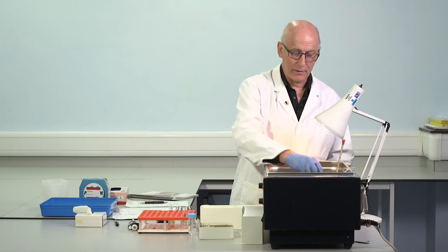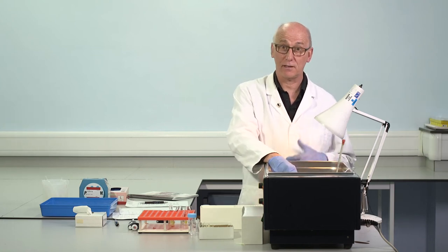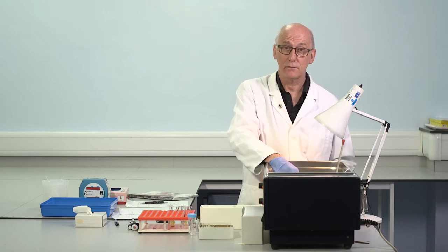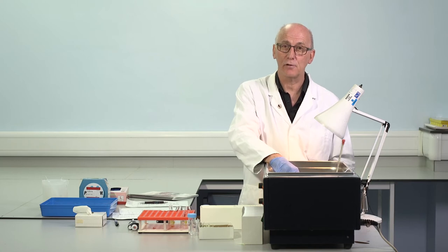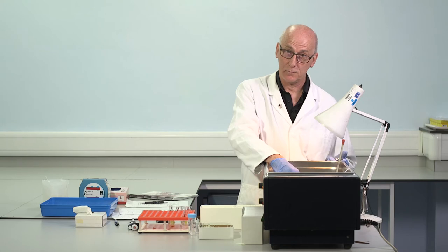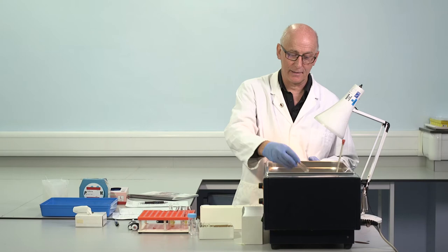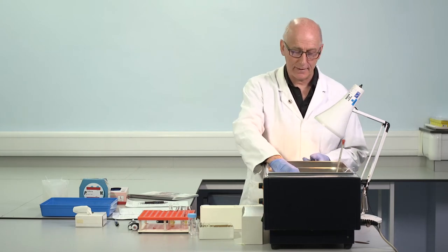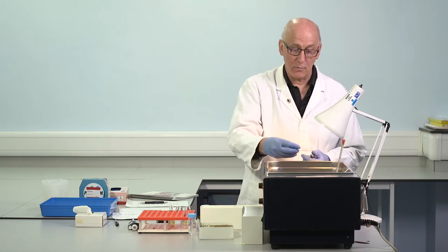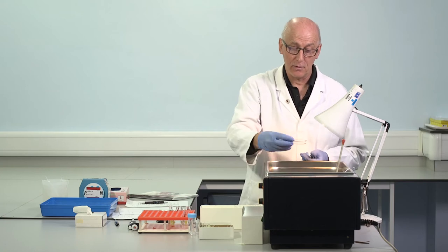If the patient sample is deficient in factor 8, let's say it were fully deficient, it completely lacks factor 8, severe hemophilia A, less than 1 international unit per deciliter. In that equal mix, simple maths, the level is approximately 50 international units per deciliter. We've added the missing clotting factor. And in this case, with a normal or close to normal concentration, we anticipate a normal or close to normal APTT.